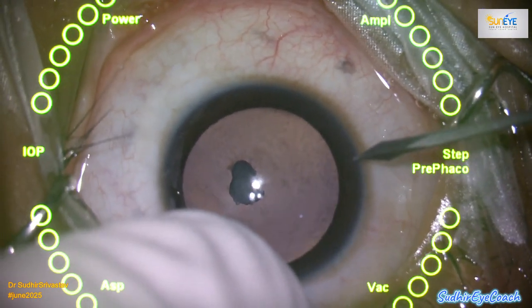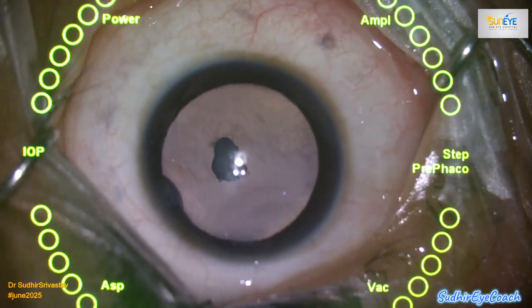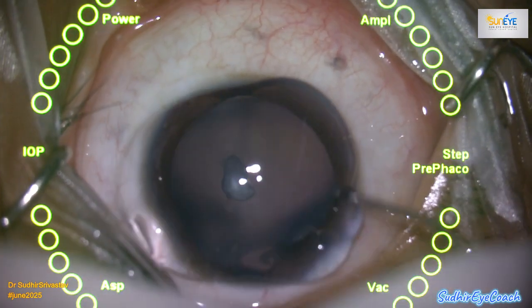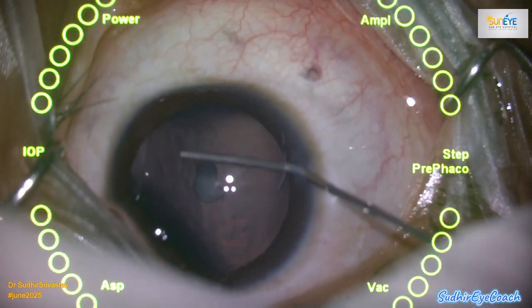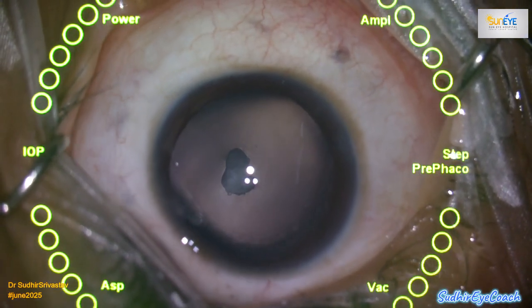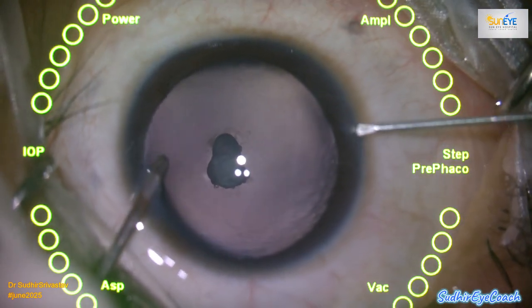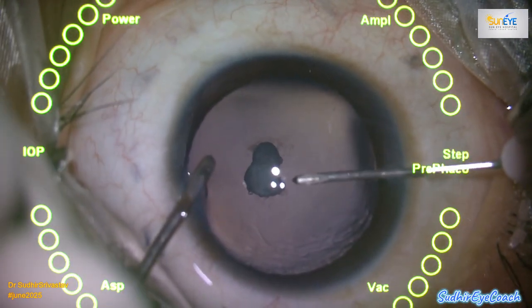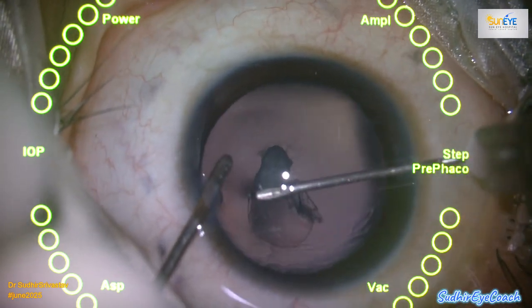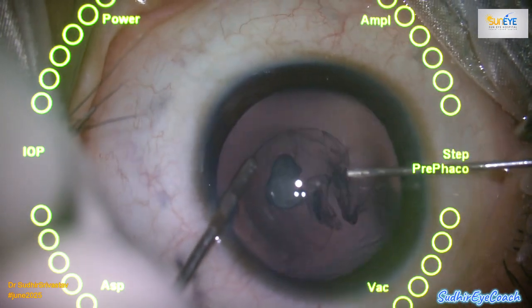Today I am sharing an interesting case involving a young patient with a posterior polar cataract. As many of you are aware, posterior polar cataracts are often associated with a weak and/or dehiscent posterior capsule, and this makes the cataract surgery particularly tricky, as the risk of posterior capsule rent is significantly higher and sometimes VR support might be required. So that is why before taking up any polar cataract, we always ensure that the VR surgeon is informed and available, and planning ahead is essential to avoid intraoperative surprises.